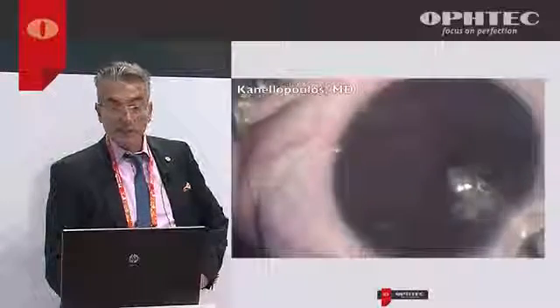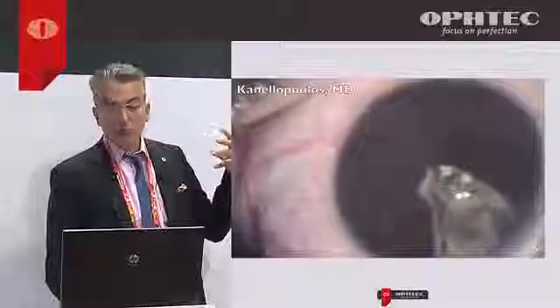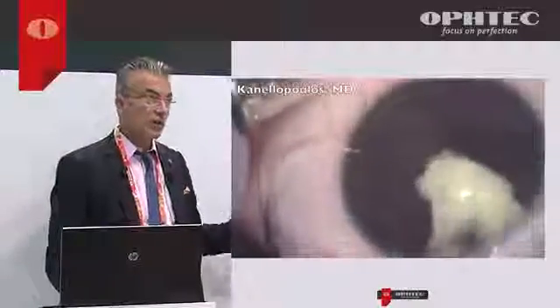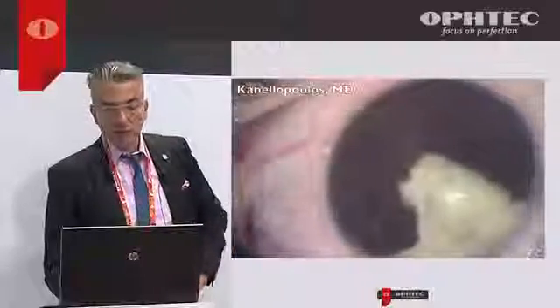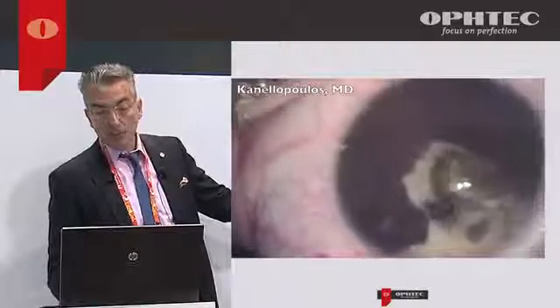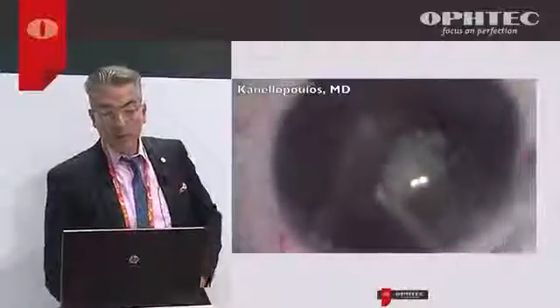So again, this is a pediatric aphakic patient that had developed glaucoma, which we thought was from the vitreous coming into the anterior chamber. So our goal here was to treat this patient's glaucoma, but also place an intraocular lens to stop the communication of the vitreous cavity with the anterior chamber. So I'm using here triamcinolone to stain the vitreous and perform a thorough anterior vitrectomy.